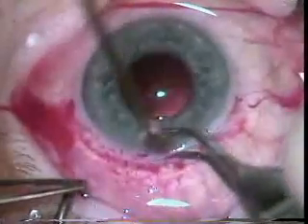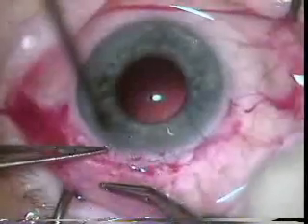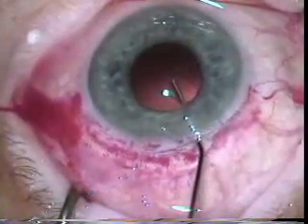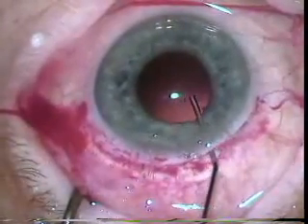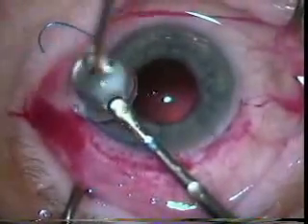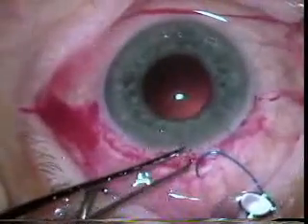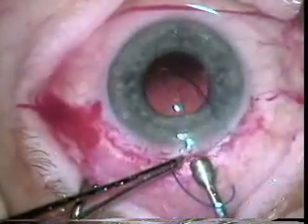Now we're just making sure that the sutures are out of the way and that there's no material in the wound. Some viscoelastic — probably a cohesive viscoelastic like Healon — is placed in the capsular bag. This is an SK-21 lens, which is an interesting PMMA lens that Dr. Colder liked, that has haptics which are made of prolene. This is a lens which he commonly used, and I still see a lot of patients who have had this lens placed that are very happy with nicely centered lenses.